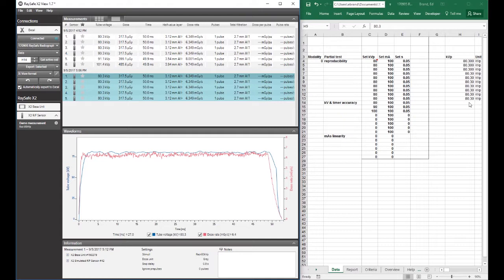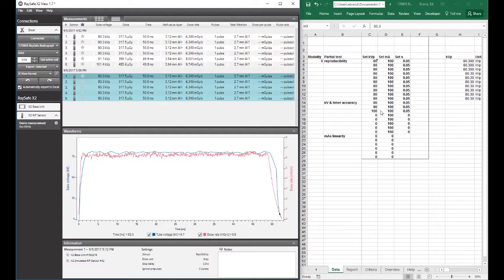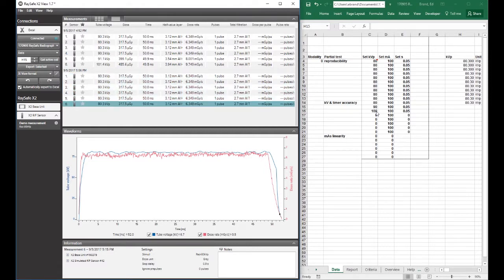Now we can do our timer and kV accuracy. And to do that, I'm going to simulate an 80, 90, and 100 kV exposure. So first the 80. And you'll see that it did populate, so I'm ready to do the 90.